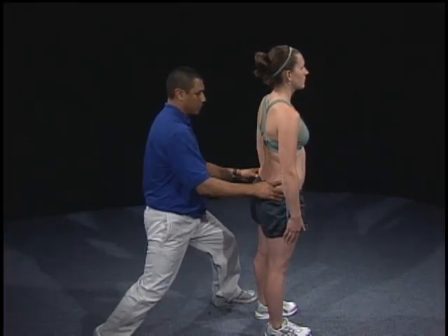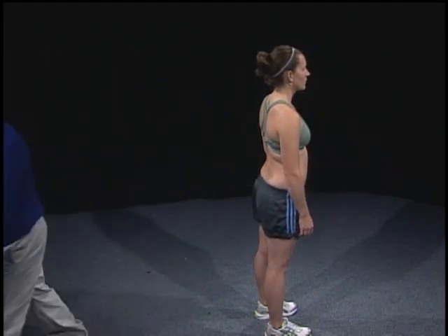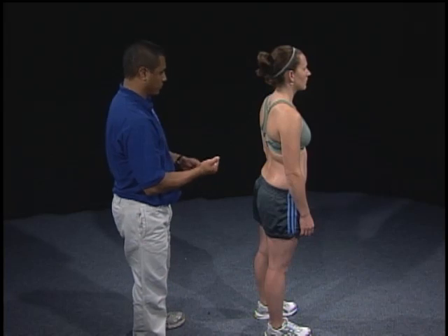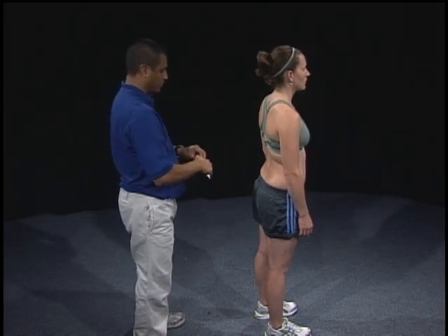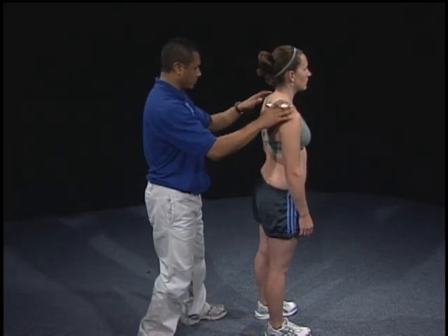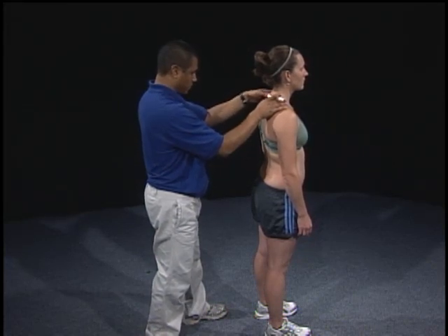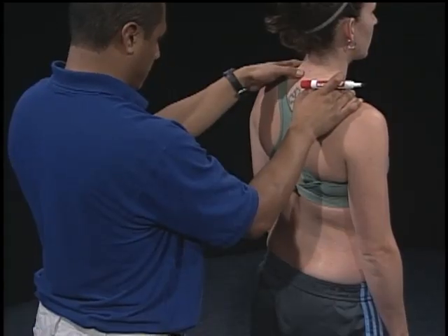Passive movement is generally not assessed due to the difficulty in moving the patient through full range of motion of the spine. The end of lumbar lateral flexion range of motion occurs when resistance to additional movement causes the heel on the opposite side being tested to rise and the pelvis begins to tilt laterally.